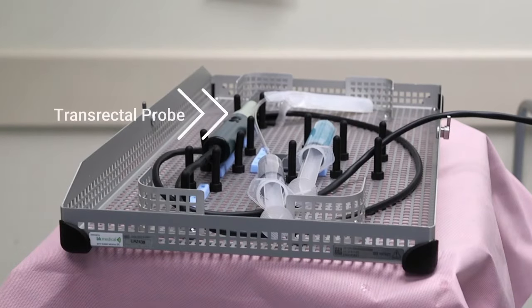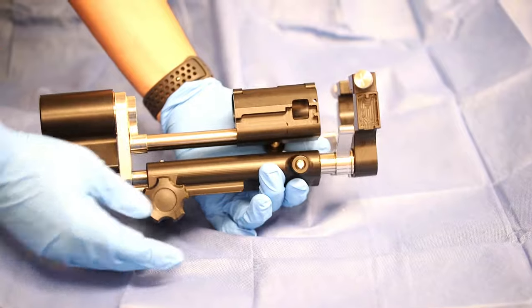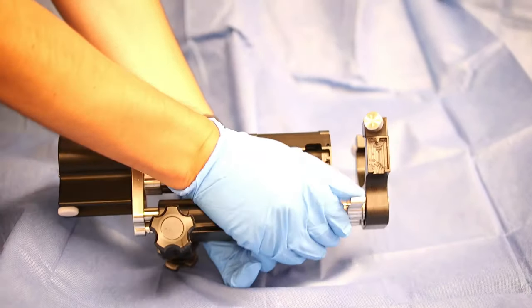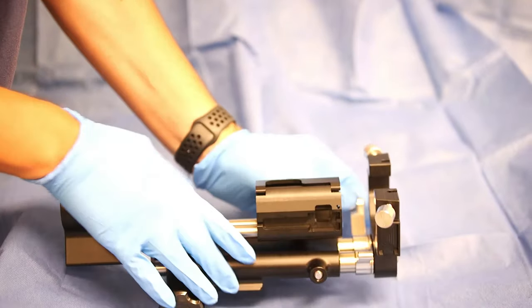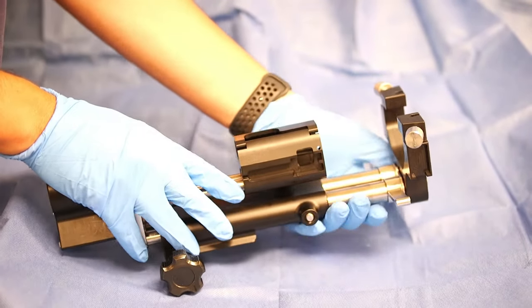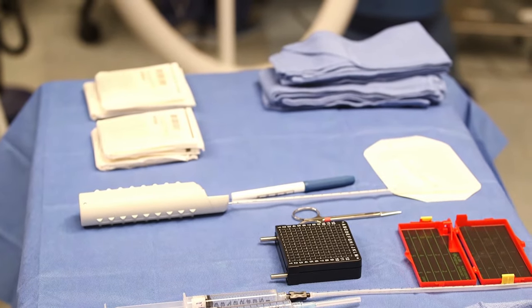The transrectal ultrasound probe is lying next to its probe cover and an attached lure lock syringe with water. A Tumi syringe is also filled with ultrasound gel. The stepper holds the transrectal ultrasound probe and grid plate. It has fins that move up and down to change the angle of the grid plate. The stepper can also telescope forward to push the grid plate flush against the perineum.